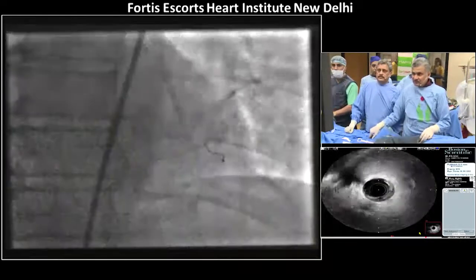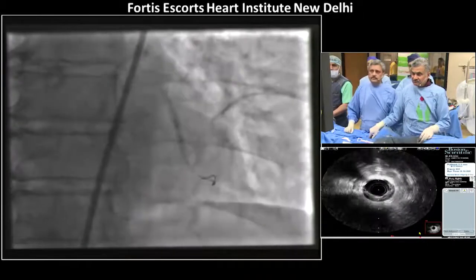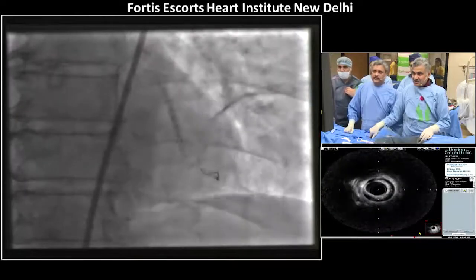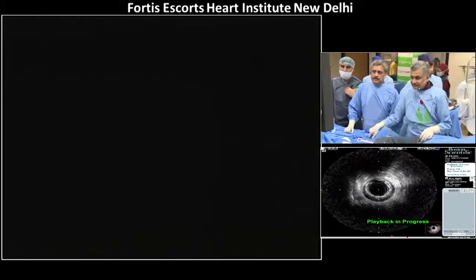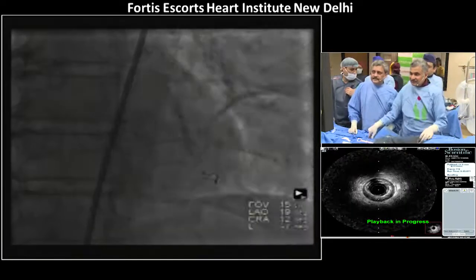Well, you're doing a great job with ischemic conditioning. There were some good collaterals from the distal LAD coming to this OM. The lateral wall was moving, which was one of the reasons that prompted us to do this vessel. Yeah, deflate.